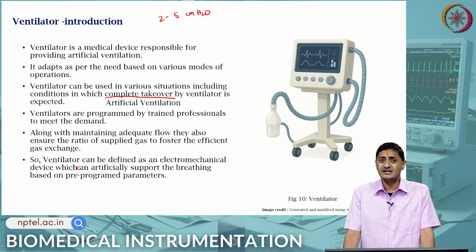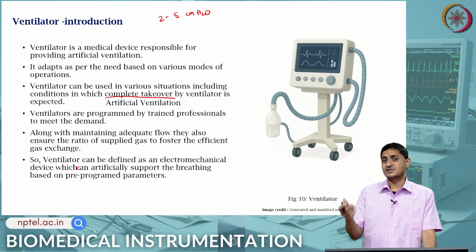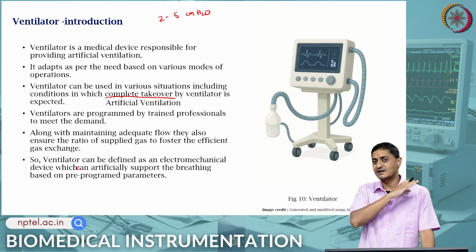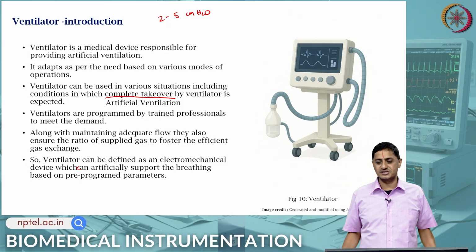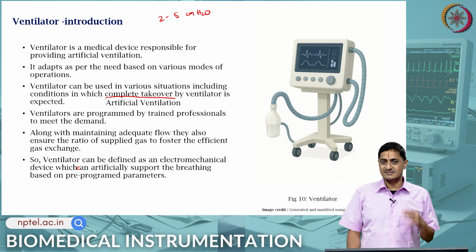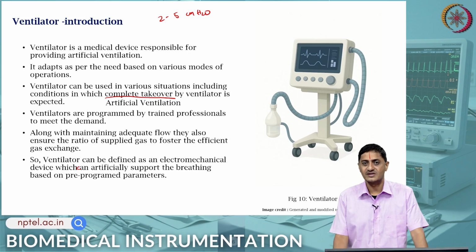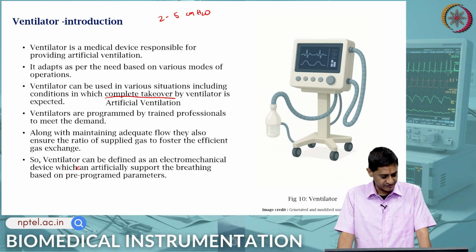The ideal ventilator is one that adapts to the situation. Depending on the situation, it might take over completely or it might provide minimal support. Now, that is the ideal ventilator that performs in the whole range of operation. That is still something that is in the works. Some of you who are interested may take that up as a career, for example, as an entrepreneurial venture. Now, let us go back to the physics.